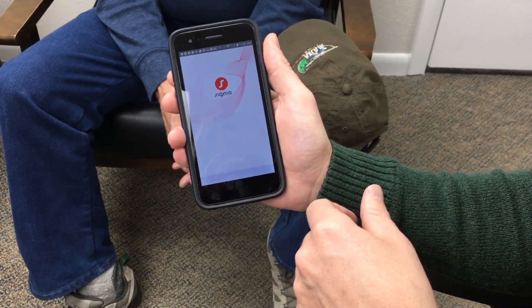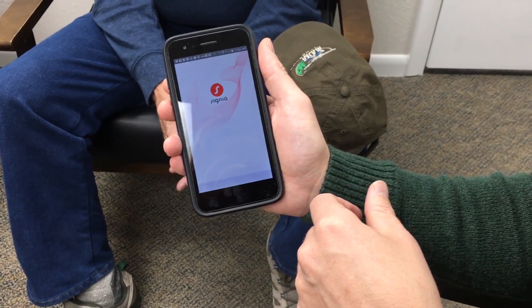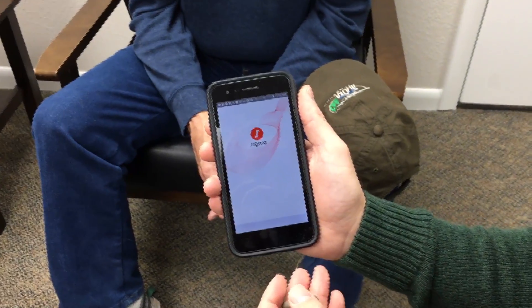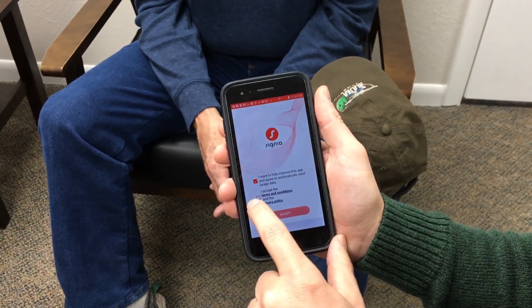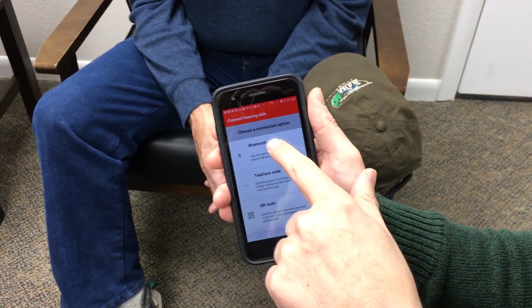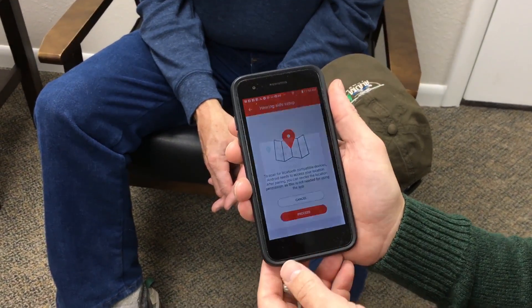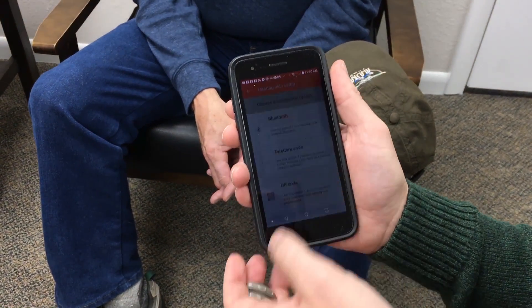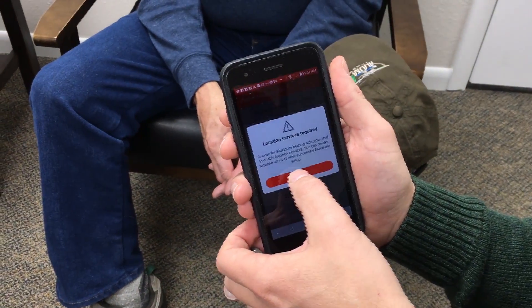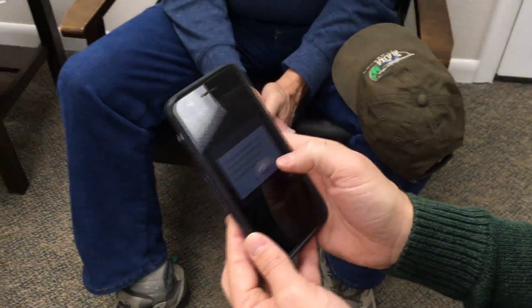We're going to go ahead and launch the app — it'll take a second to load. Once it does, we should be able to connect using Bluetooth. We'll accept the terms. From the connection options, I'm going to hit Bluetooth, hit proceed, and allow it.